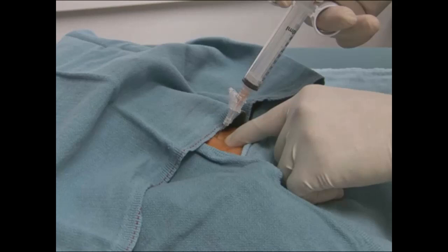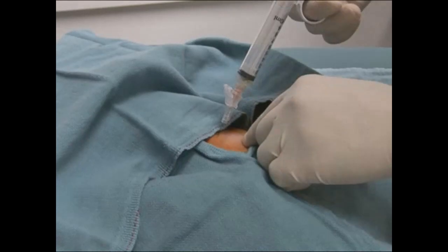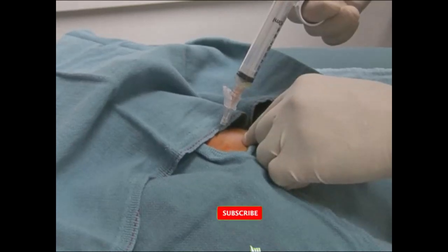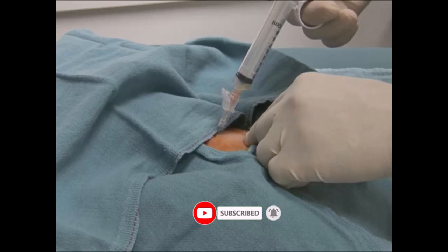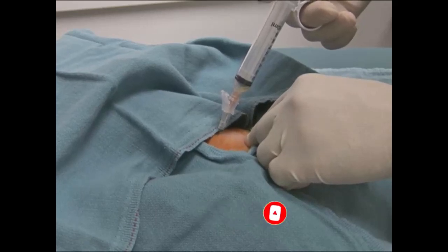The syringe plunger is retracted on entry to the subcutaneous layer to create negative pressure. Typically the needle will be inserted 1-2 cm to reach the bladder. Once the bladder is entered, urine will be drawn into the syringe.